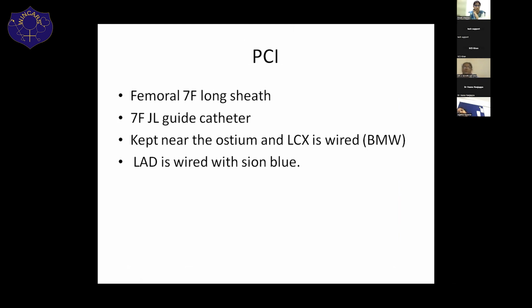The patient's attendants were not willing for a high risk procedure, and we also told them to be referred to a higher institute because even transportation is high risk. They were not willing. So we reserved our decision; we felt we would take the decision after doing IVUS, because we can find the lesion characteristics and decide based on that.